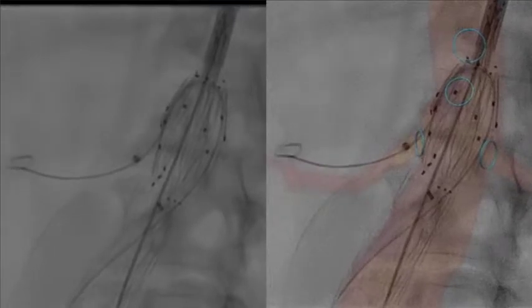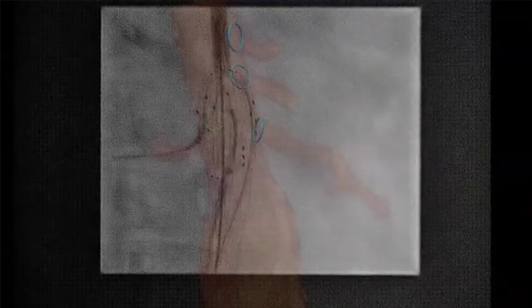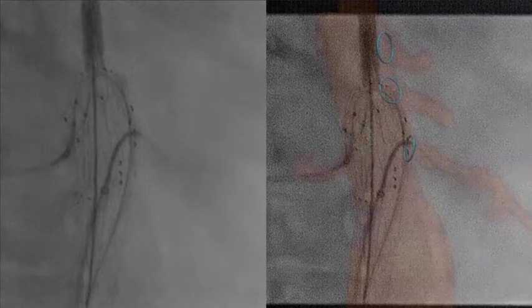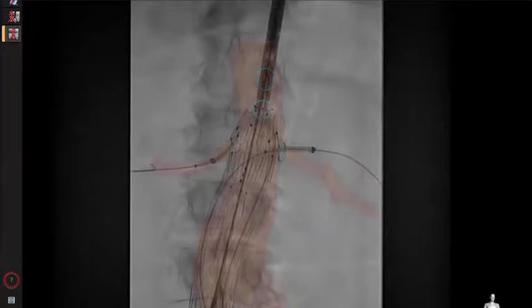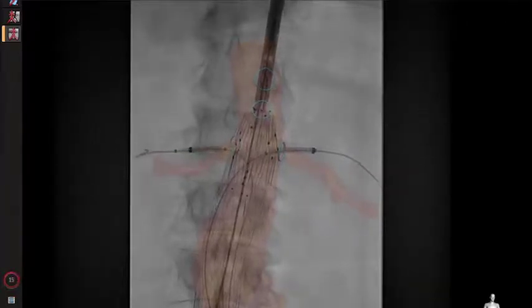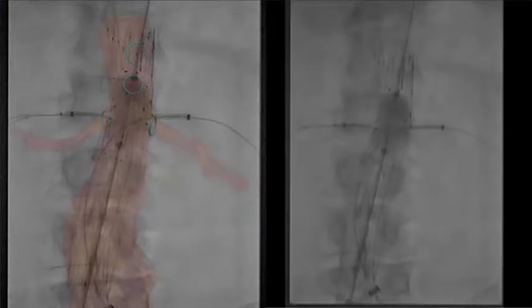We pass our ICAST stent into position, then move over to the left. You can see the graft is slightly high, as we typically do — easy to pull the graft down, hard to push it up. We cannulate the left renal, advance the catheter, give one more small puff, and deliver the sheath. We position an ICAST in the left renal, pull the right sheath down to get that ready, then deploy the top cap and withdraw the delivery system.